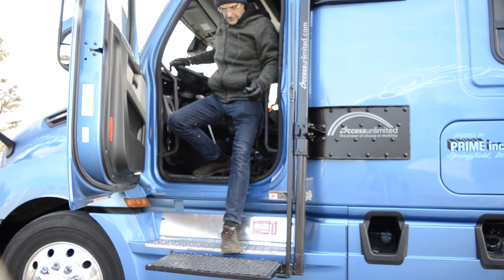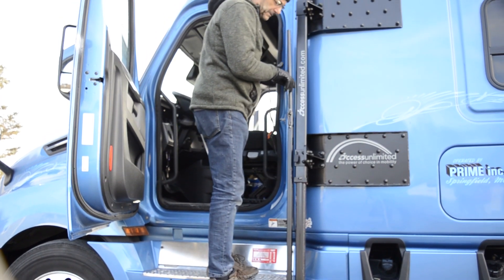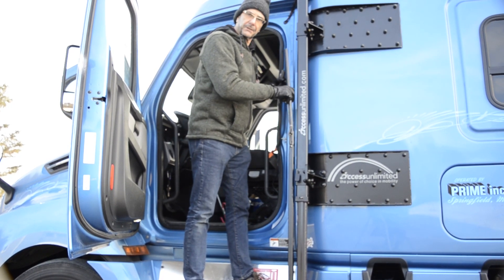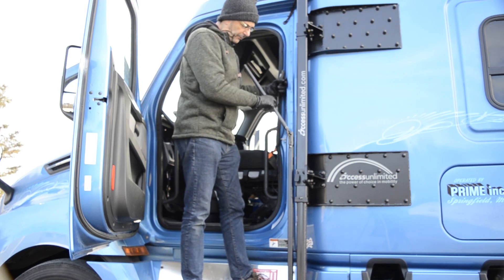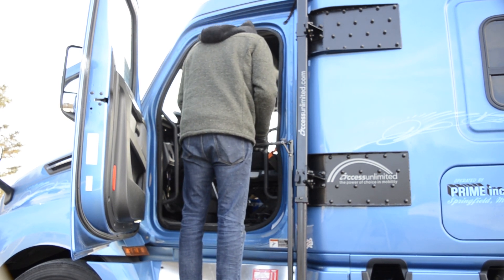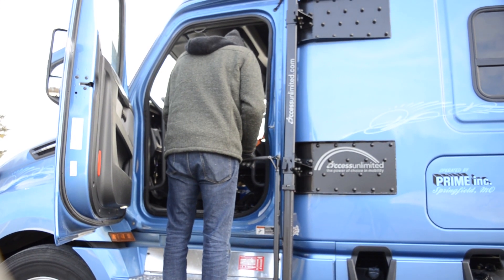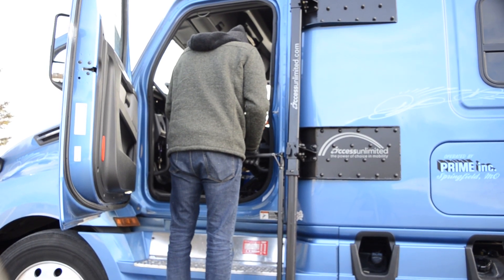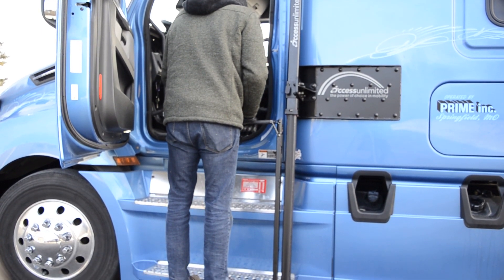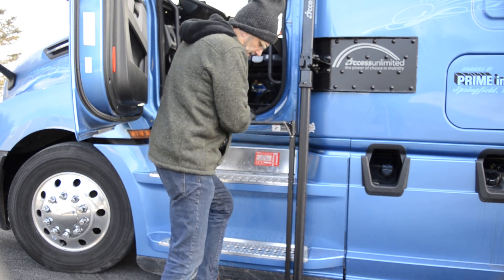Depending on your situation, you can just come right out here depending on your level of mobility. This device has a spring on it that actually pulls it right down. You want to make sure it's all the way down before moving. Always be facing inward for safety reasons when using the system.